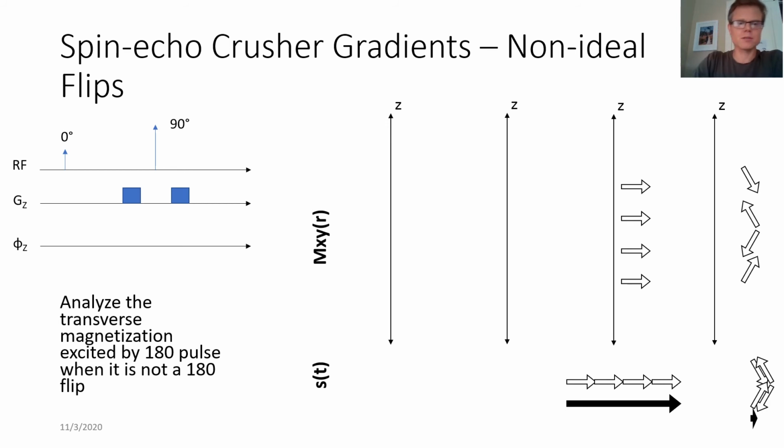So to do this, we have our flip angle set to be 0 for the first pulse, so a component or net magnetization that remains longitudinal. And in fact, what that means is that it has no phase accumulation.